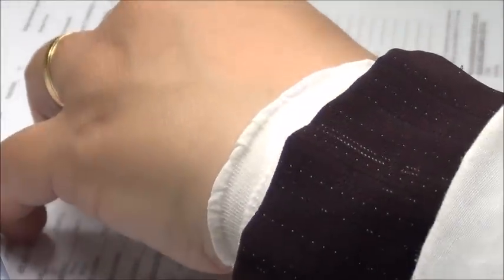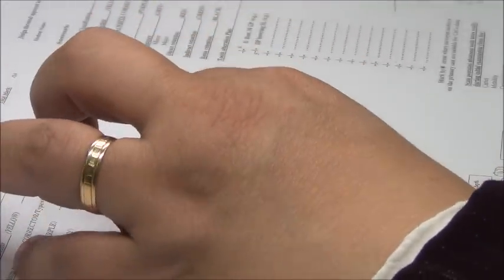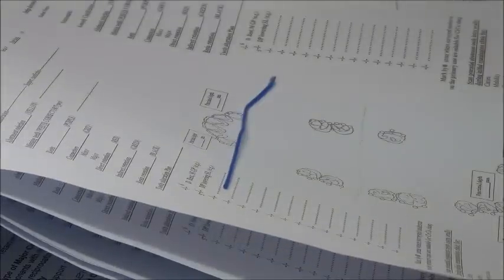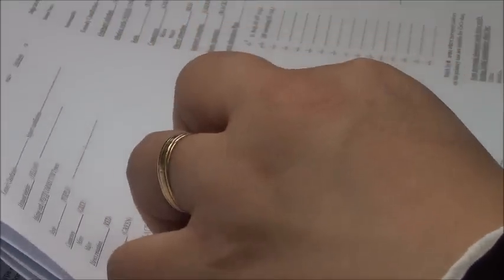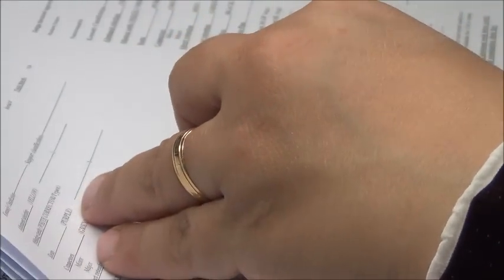If I'm talking about this fulcrum line, I have a rest here and a rest here to prevent rotation. These are not principal fulcrum lines. The principal fulcrum line is this one, the last one. But these are fulcrum lines, lines running through the rests. These 2 posterior rests are preventing them. This is the principal fulcrum line.